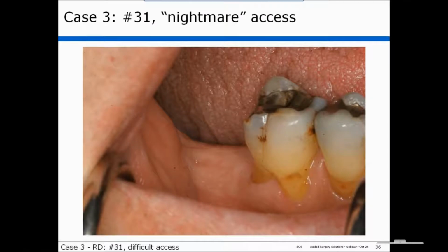So is that something that you scan, or is that something that the doctor should have scanned with the patients? Well, we find that docs who have scanners in their office do it themselves, or if someone sends us a model, we'll scan it for them.